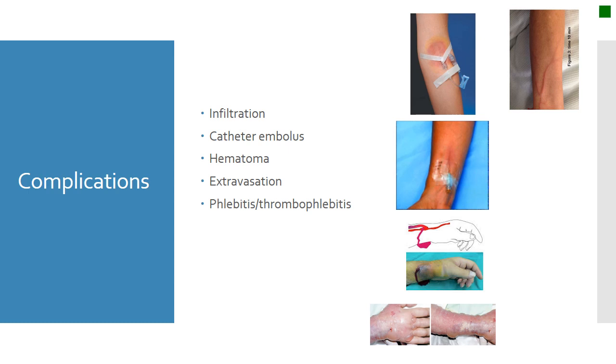You may need to culture the site in order to get a good treatment of whatever infection it is. So when you remove that IV, you may need to keep that catheter. It may be requested for a culture. You can prevent this by rotating your sites every 72 hours or sooner or per protocol. That's why in hospitals, typically we only want them to stay for about 3 days.